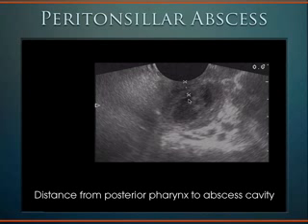So we measure this distance, and we know that the needle only needs to go about 1 centimeter before it's going to start to get to some pus. And it definitely is going to stay away from these large blood vessels back here. So that's one way we can help guide the procedure.